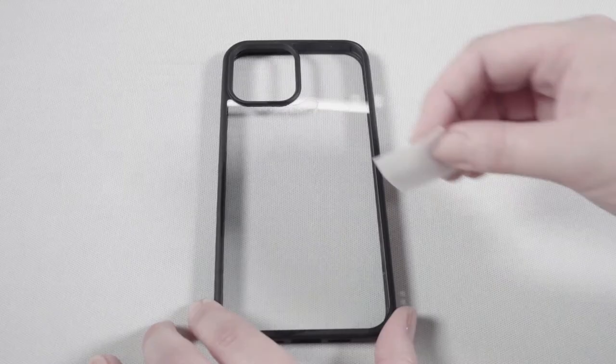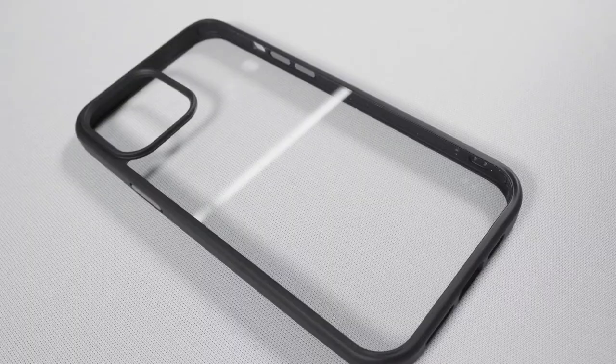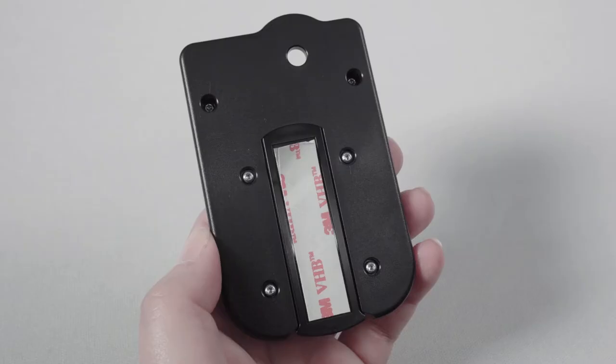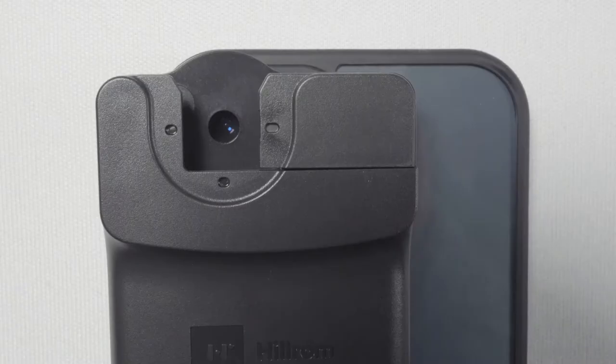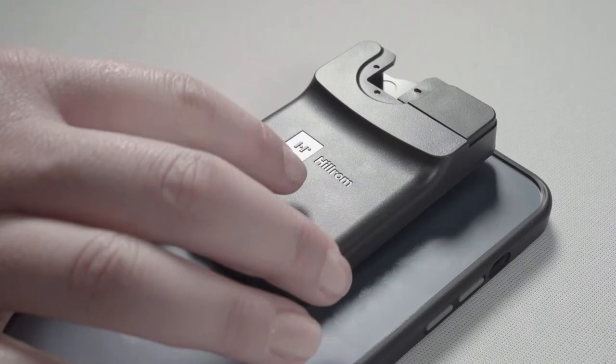Clean the back of your case prior to attaching the adhesive strip on the smart clip to your device. This will help ensure the smart clip stays securely fastened. Peel back the film covering the adhesive strip on the smart clip that is inserted into the smart bracket accessory. Center the primary camera lens with the round hole on the smart bracket accessory. Make sure it is straight and aligned before you press down. Press the smart bracket accessory and smart clip down onto the case with pressure to ensure it is secured.